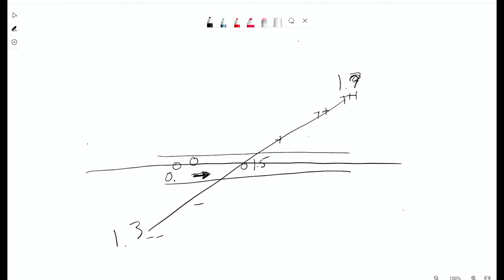So if I've got three protons here. Okay, hold on just a second. There we go. 3 protons here, and we always measure protons moving in centimeters per second. Let's say this proton is moving really fast, and during this acquisition, they're going to start here and end here. This proton is moving.